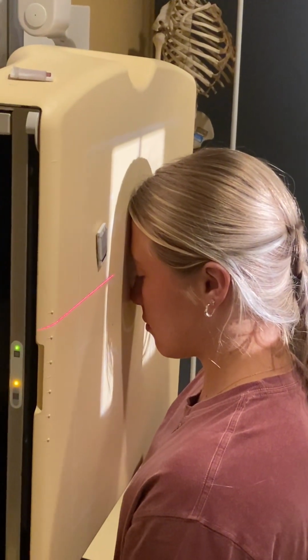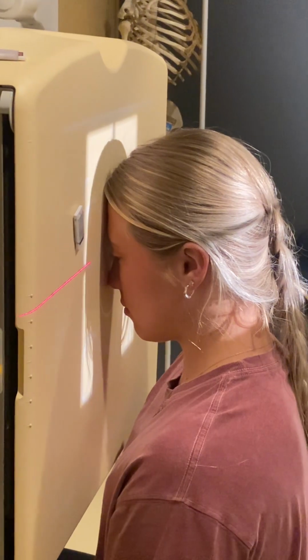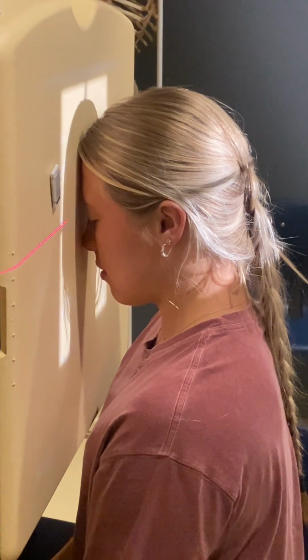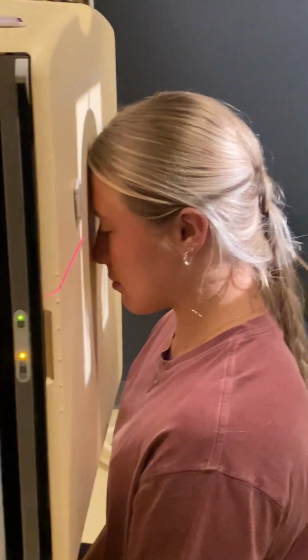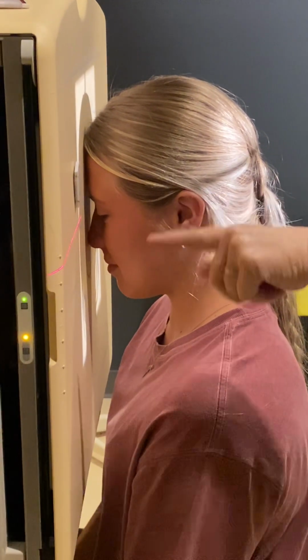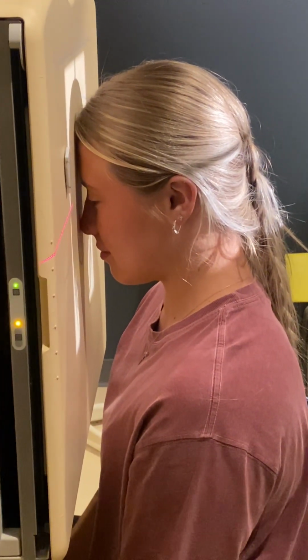So maybe a millimeter. I'm almost there. All right, I like that. You know, let's come up and look at that just briefly. So that's exiting the nasion. You know, you got to get right up to your patient and look at where the nasion is, and you got to look at that. All right, that looks good. So I'm going to realign to the Bucky.